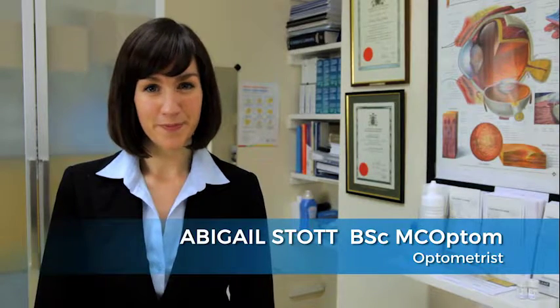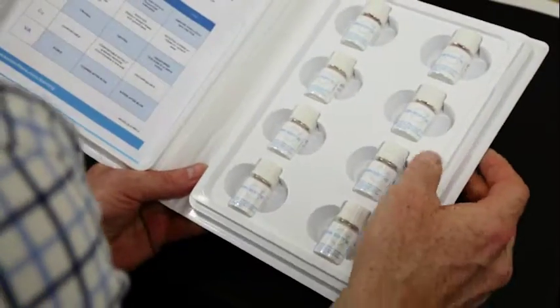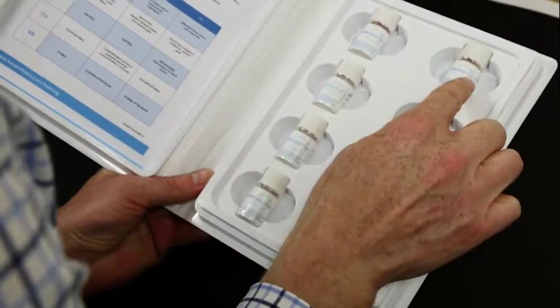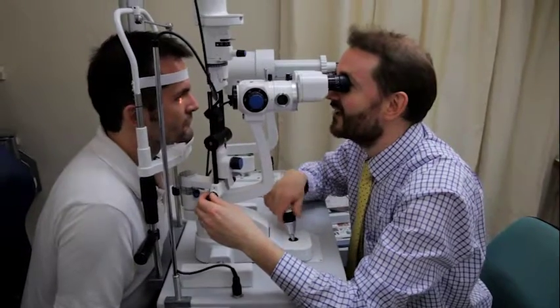This module will guide the practitioner through the process of assessing the corneal shape. Determining the corneal shape is an important first step in the process of fitting the KeraSoft IC lens. It will identify which lens to try first from the diagnostic set and help the practitioner to understand the subsequent fitting characteristics of the lens.